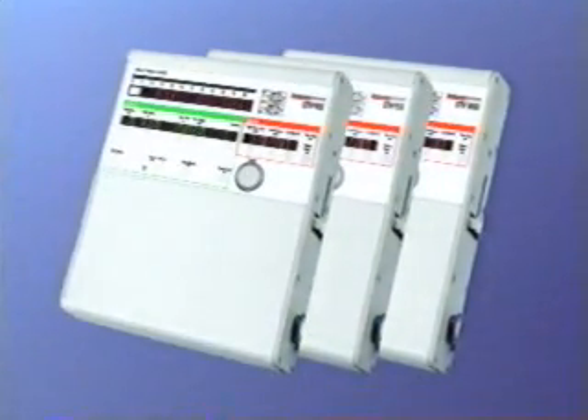Pulmonetic Systems Incorporated is pleased to present the LTV Series Ventilators. LTV stands for Laptop Ventilator. The LTV is small and lightweight, like a laptop computer. The LTV has all the capabilities of many larger ventilators and more. It only weighs about 12 pounds but packs a world of innovative features into its small size.